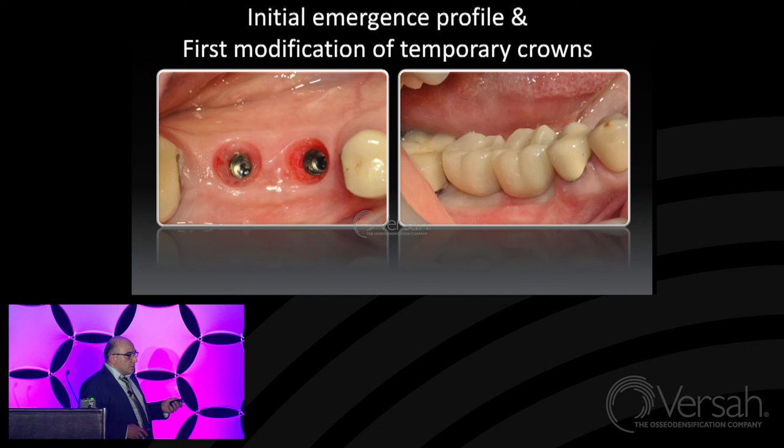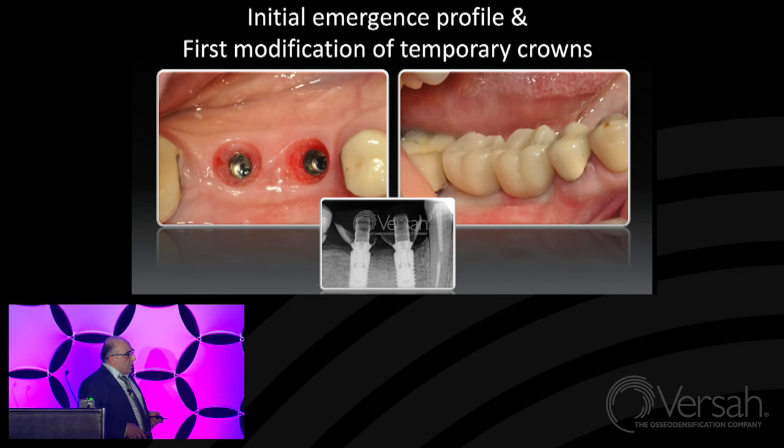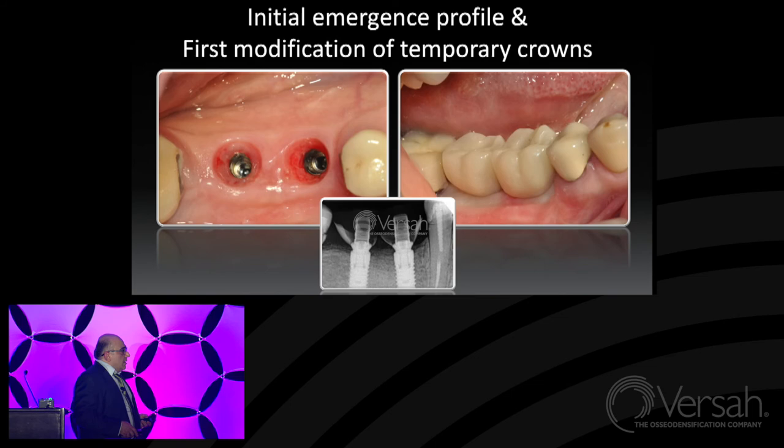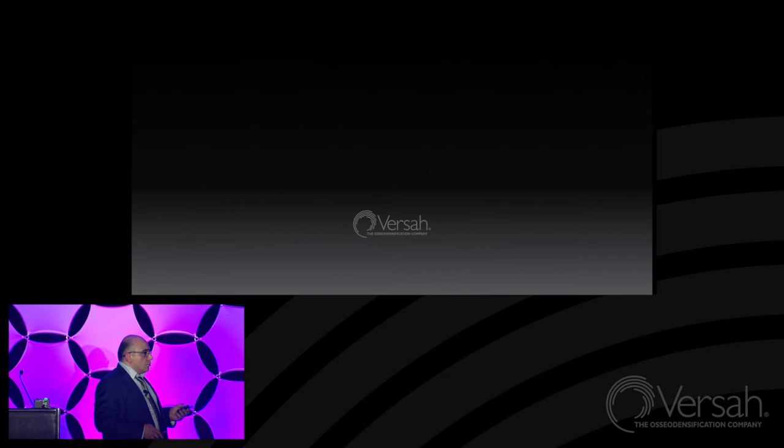It's very important. This is the amount of flowable composite which we add to the cervical part of the implant. And of course, as I say, we have to polish it very carefully and very meticulously. Otherwise, it will collect some food remnants and we will get some perimplantitis or perimucositis at least. The patient is well instructed how to care for the temporary crown, how to clean it using floss and everything which we have in our arsenal.